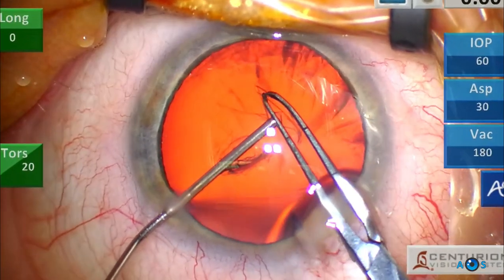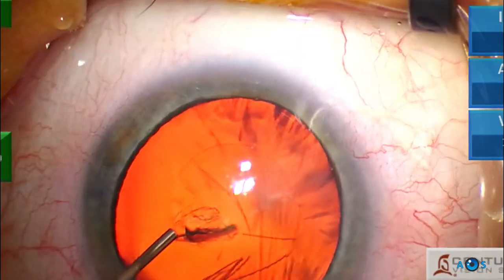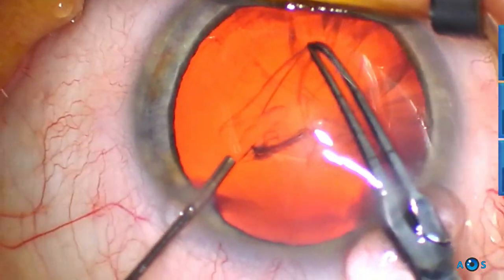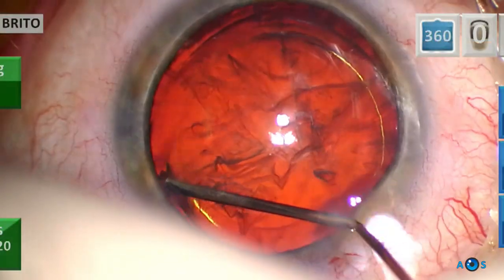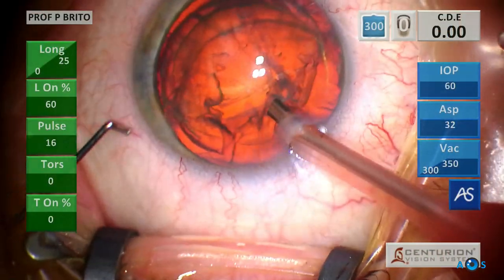A centered round capsular rhexis is even more crucial when using premium lenses. Beginning with a cystitome and then frequent grab and release maneuvers of the capsular flap is a consistent method to achieve a nice round rhexis. This is a young patient with a soft lens, therefore during hydrodissection it is easy to prolapse the crystalline lens for easy emulsification.